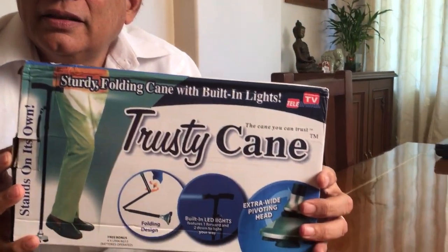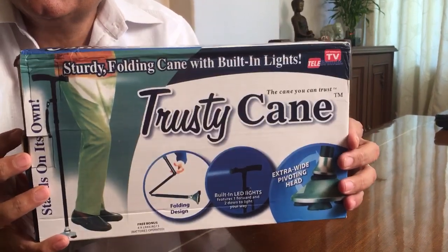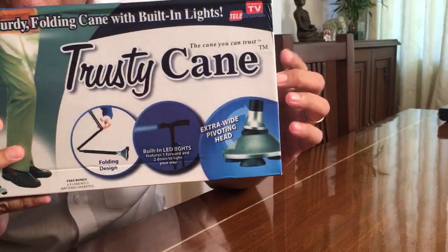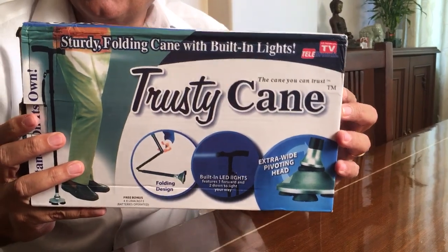Today's product is called the Trusty Cane. This is an ideal product for elders, if you have elders in your home. Now let us unbox this product and see the various features of the product itself.